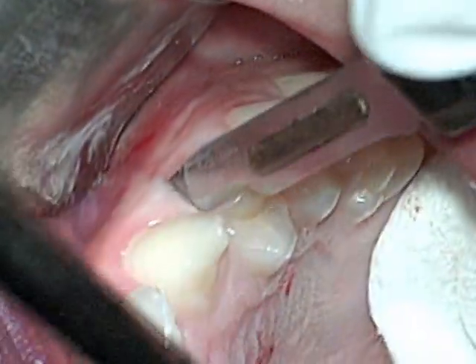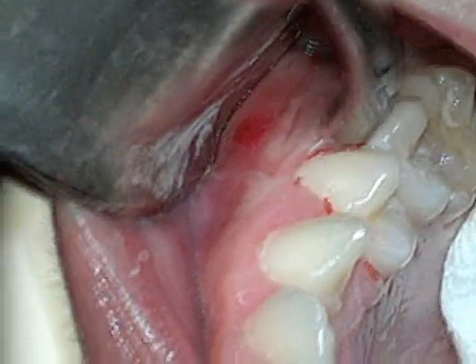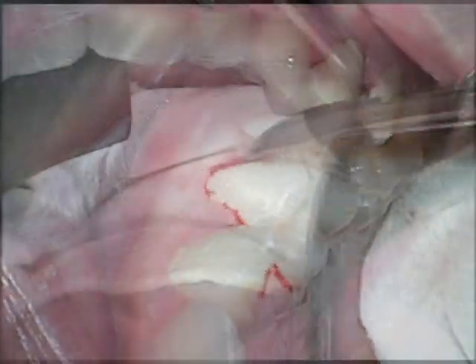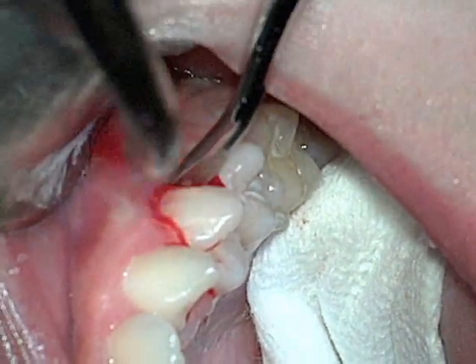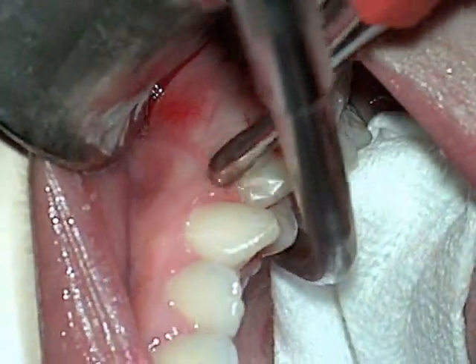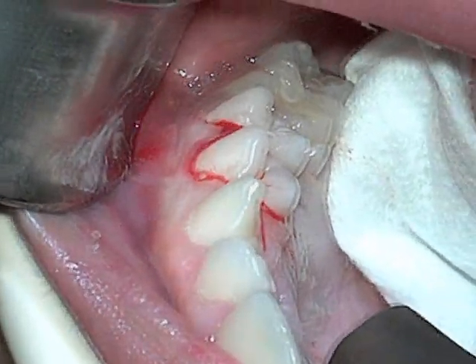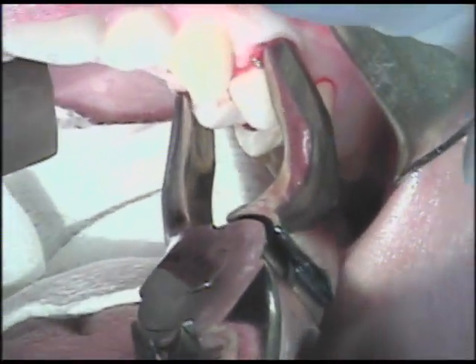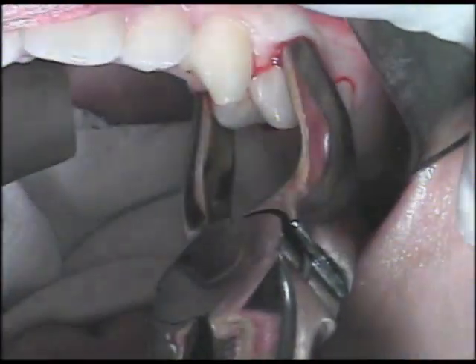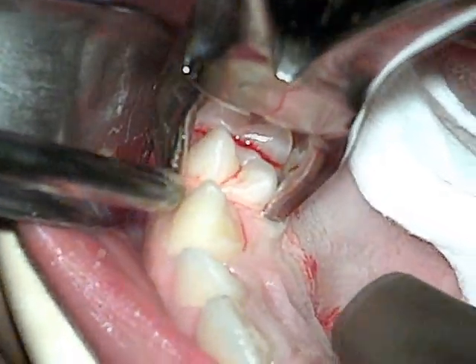So I first take my number 15 scalpel blade and I make a sulcular incision on the facial aspect and on the palatal aspect. We're starting first with tooth number 12 on the upper left. Take my periosteal elevator and push the tissue back slightly, and then I'm going to go in with my 46R elevator and just slightly luxate the tooth. Then I'm going to bring in the apical retention forcep, and I'm using an upper universal apical retention forcep, and I'm going to slip it as far apically down the root as I can, making sure I'm subgingival and I've got the root held pretty securely.